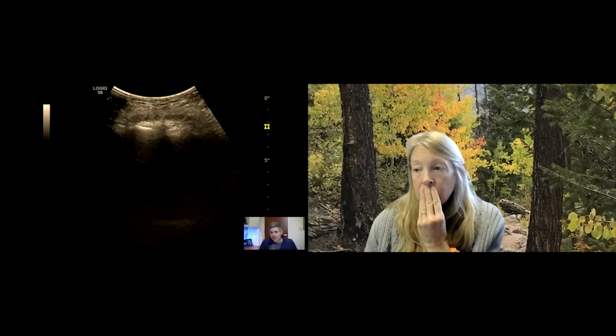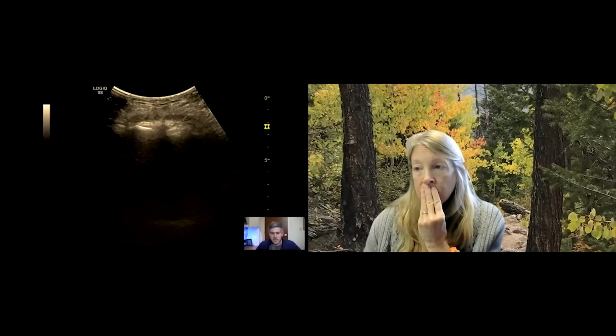I describe it as a T, right? So you have your pubic symphysis, the different bones, and they come together, right? Just like this, and the symphysis is right in the middle. So to me, it looks like a T, the top of the T, the bottom of the T, right here, just like that. That is the anatomical landmark I'm looking for, that little hypoechoic spot in between the rami of the pubis bone, indicating that I'm on the bone.